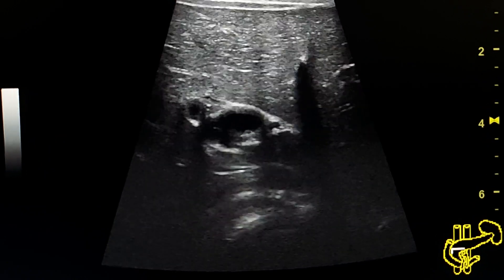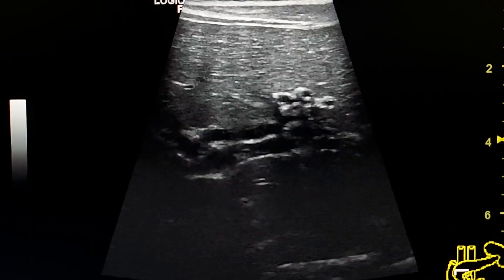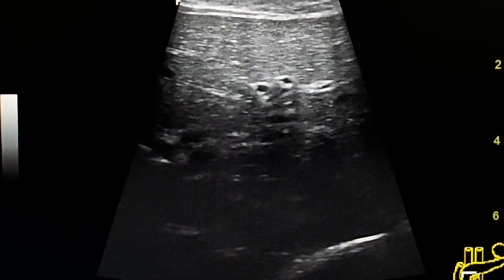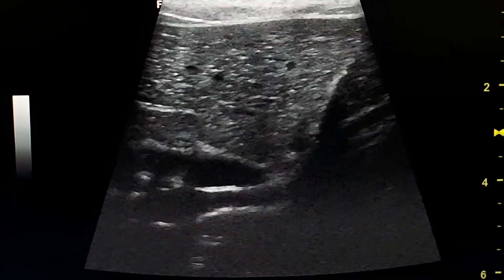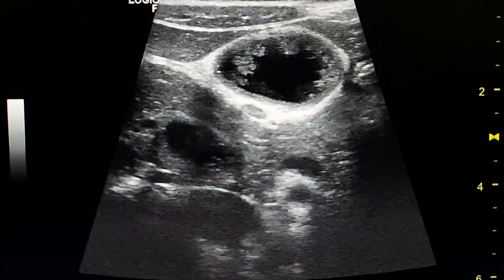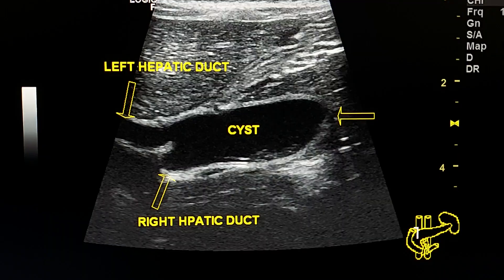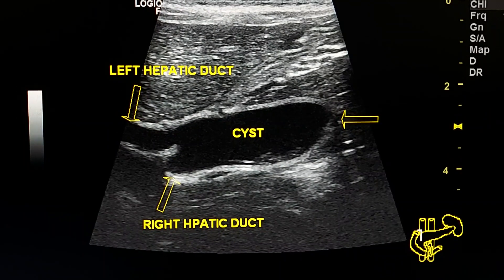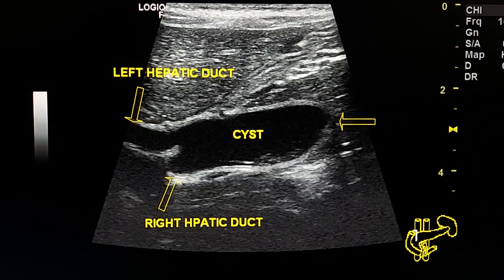This is a transverse section. This is a transverse section at the hilum of the liver. Another transverse section. Type 1 choledochal cyst.